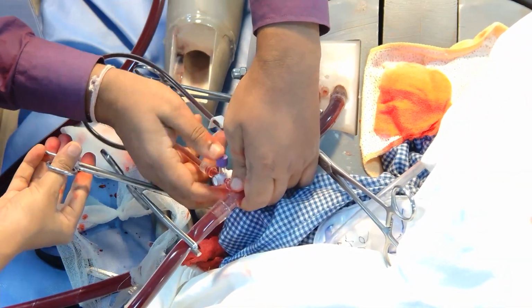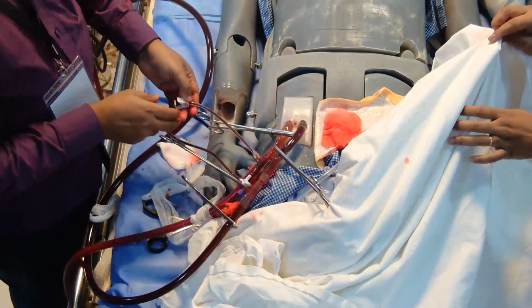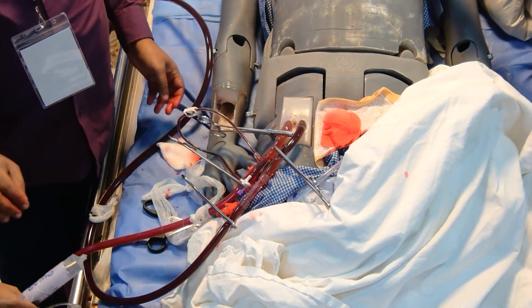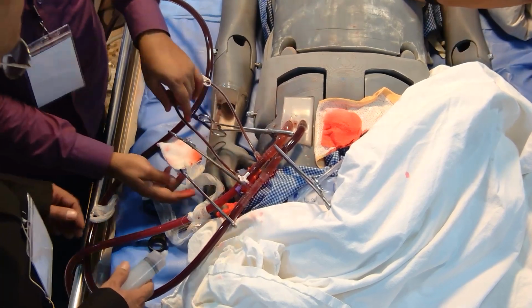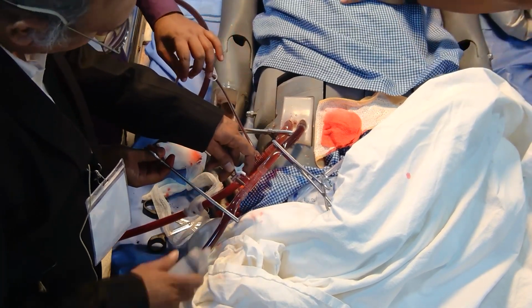And once you have connected it air free, you can always use this 3-way to aspirate and see there is no air. Okay, on either side if there is air you have to just de-air it.